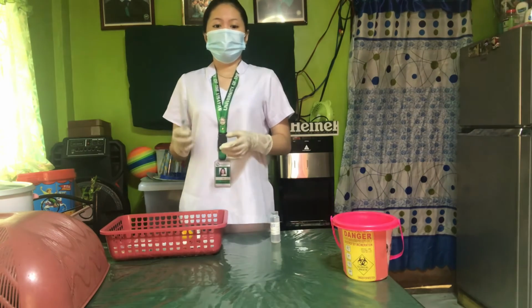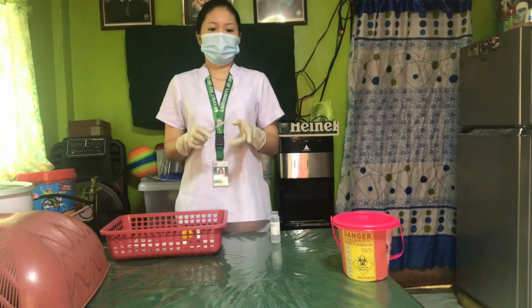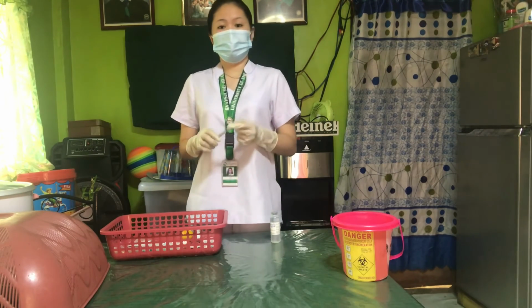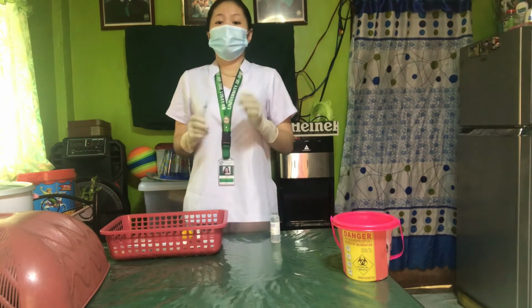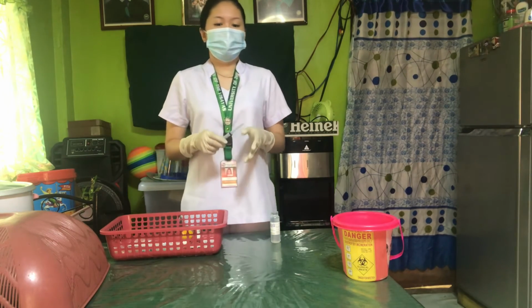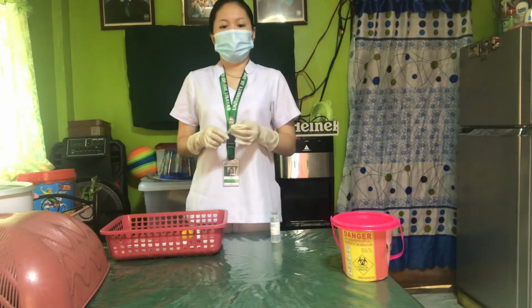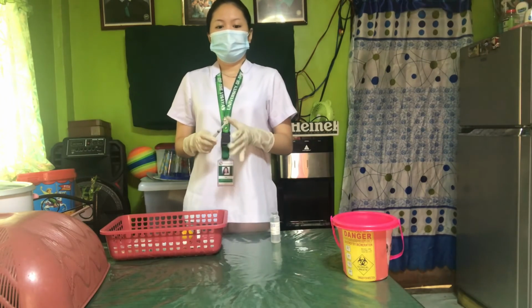Next is remove the cap from the needle, then draw up into the syringe the amount of air equal to the volume of the medication to be withdrawn. Before fluid is removed, injection of an equal amount of air is required to prevent the formation of a partial vacuum because the vial is a sealed container.